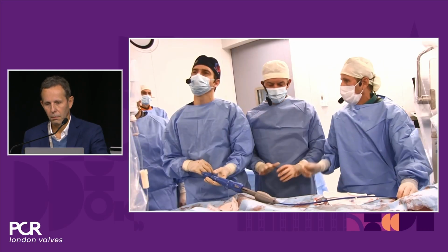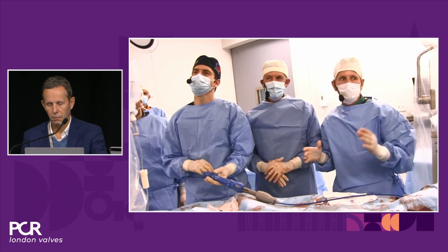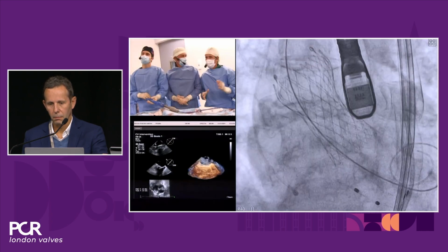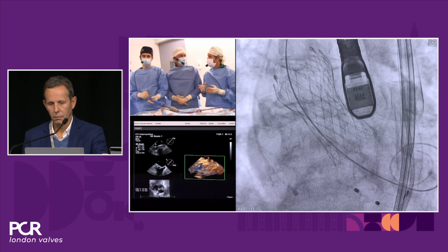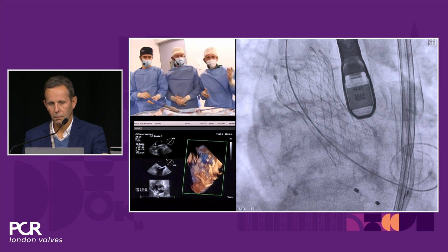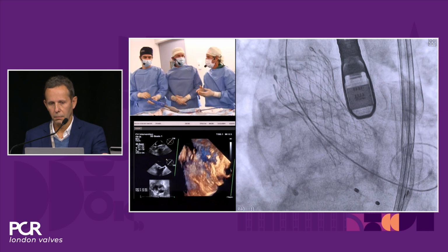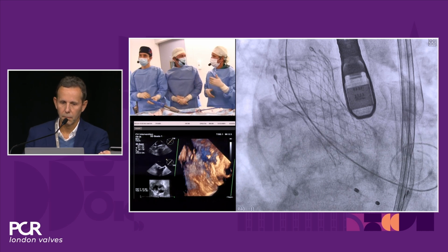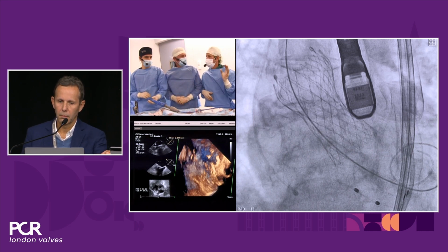Excellent. So I think it's a very good position. And the other very important point that TEE helps us on this kind of procedure is in the evaluation of PVL. Of course, we have to decide whether to post-dilate or not, and that depends on what we get on gradients and PVL. If we find a higher gradient or PVL, we'll post-dilate, relying only on echo.